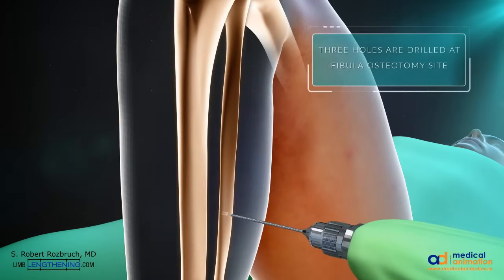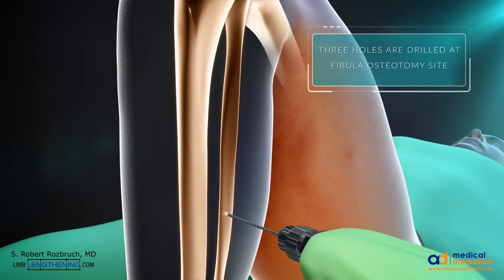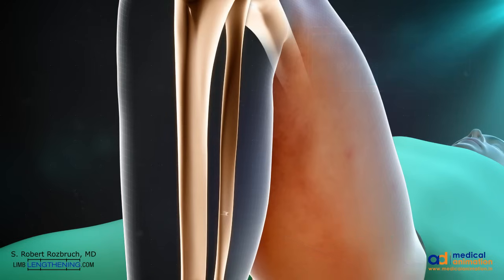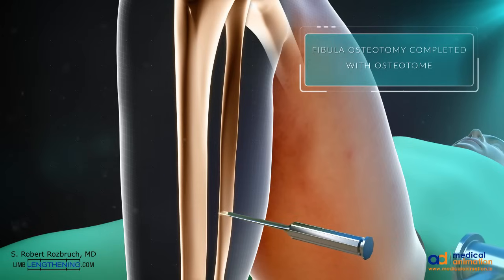The first step is fibula osteotomy, which is done by making three small drill holes in the bone. This is followed by completion of the osteotomy with an osteotome to achieve a low-energy osteotomy.